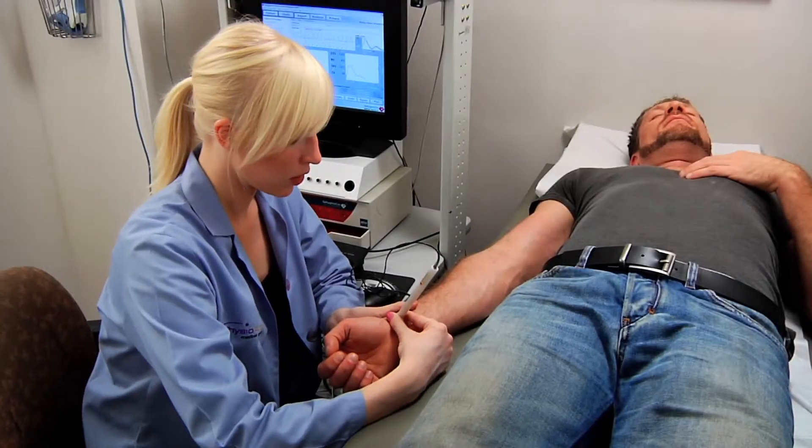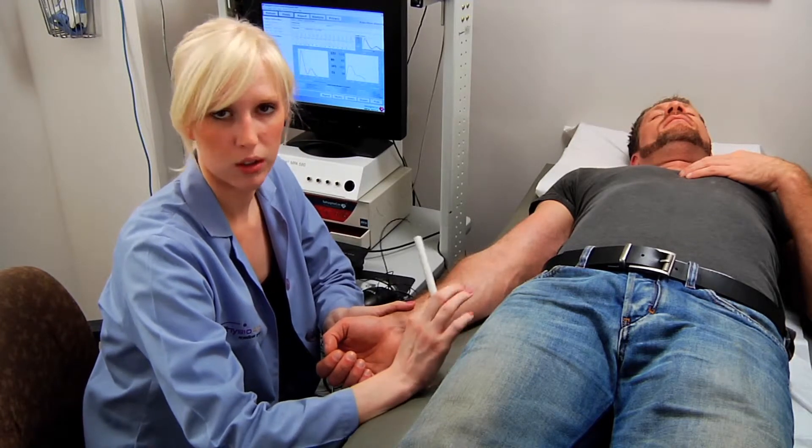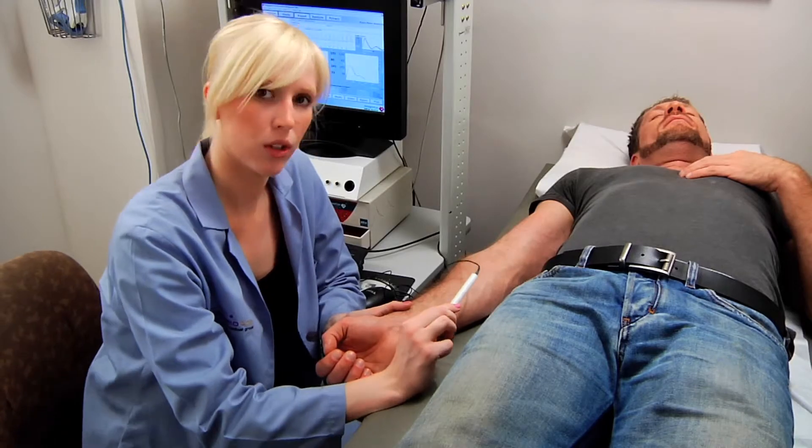In combination with that movement and those little tricks, you'll be just fine. And practice — practice on everybody you can so that you can get really good and fast at the test.